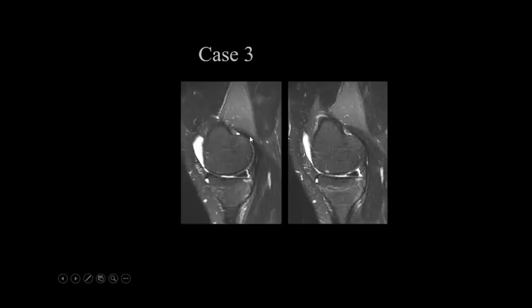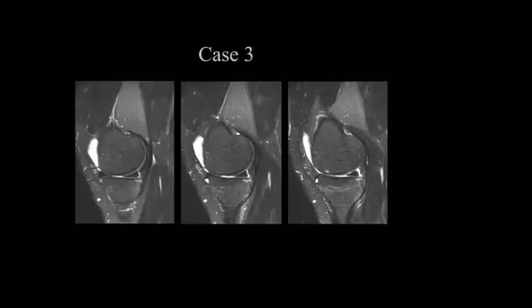And also, sorry, we have another case here, if we have a candidate to look at these MRI images.